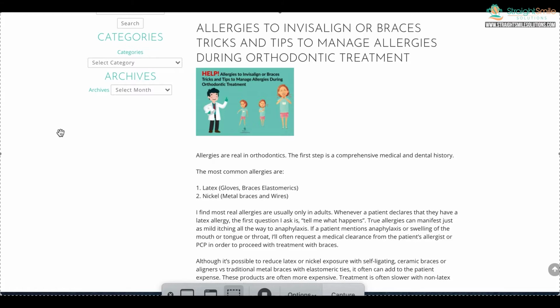If you're getting some type of inflammation, it might be better to just clean them with simple water than an actual cleaning crystal, cleaning solution, cleaning spray, cleaning foam, or anything like that. Some people even use just hypoallergenic dish soap, flavor-free stuff, the same stuff you use to clean your dishes. That might be the best thing to use. I know that sounds a little weird, but if you're concerned, you don't want to use toothpaste because it tends to scratch it. So that would be my suggestion.